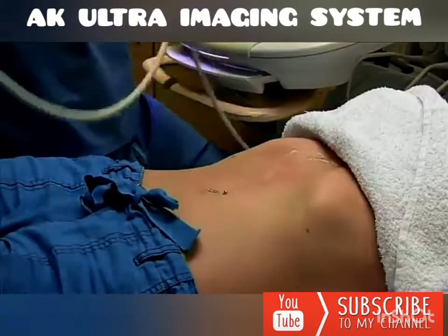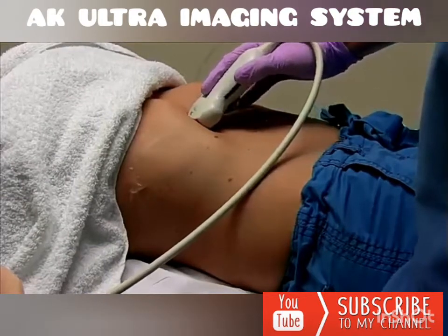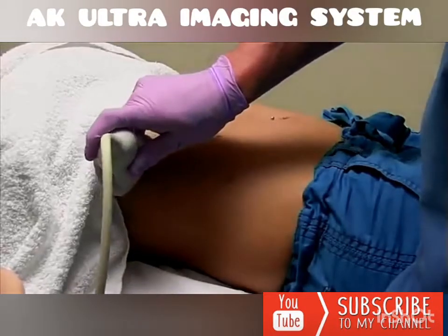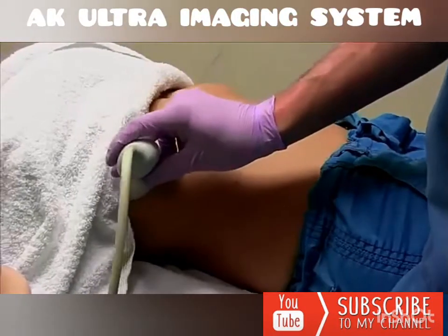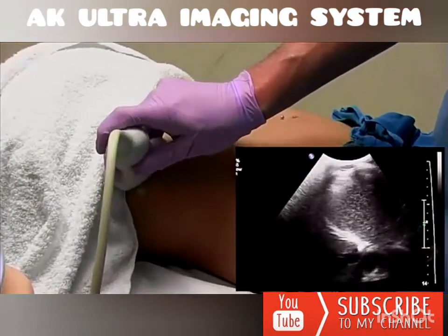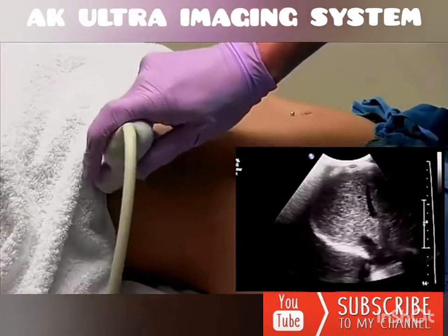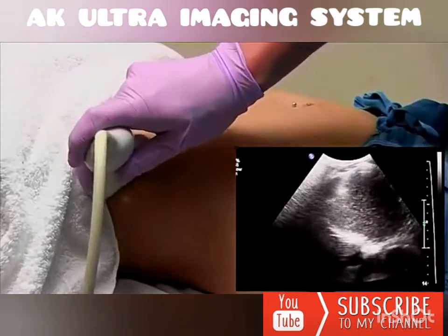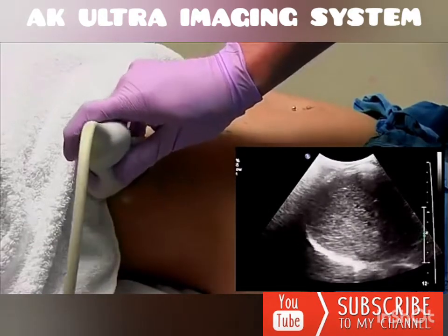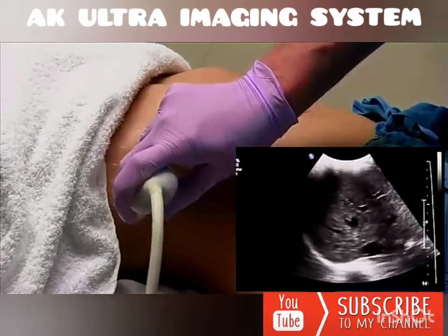And now we're going to go to an intercostal window. After you finish your transverse sweep subcostal through the right lobe, we're going to move to the intercostal window. For this window, you're going to want to make sure that your probe is slightly obliqued, because you want to fit in between each one of these rib spaces to get the best view of the liver. You start again up at the top of the liver, and you sweep through the top rib space here. Next you come down a rib space, sweep through again.